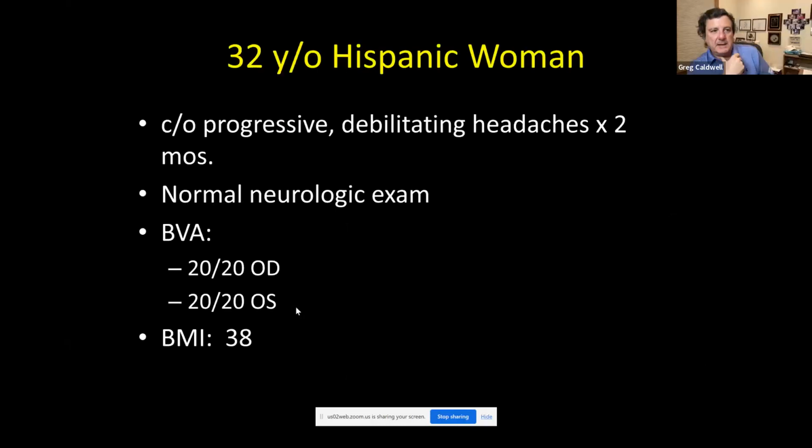And if it's bowing inward... Hey, Len, can I make a comment? Sure. Yeah, go ahead.